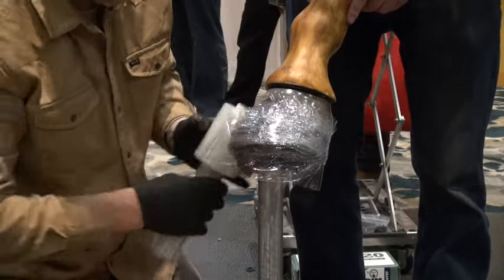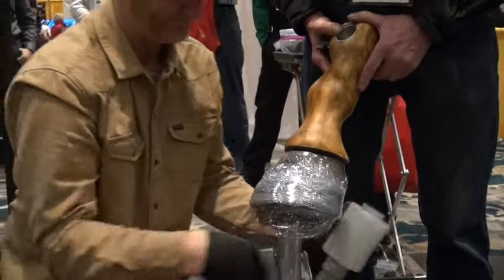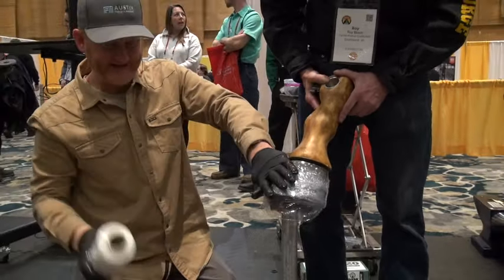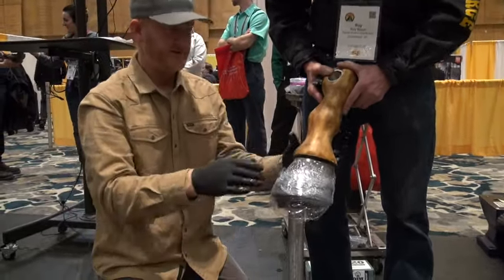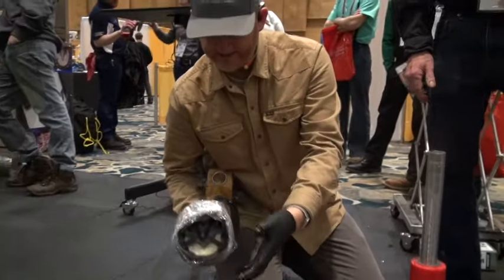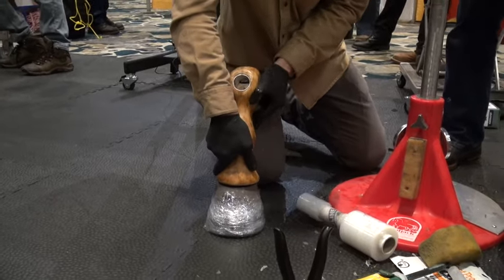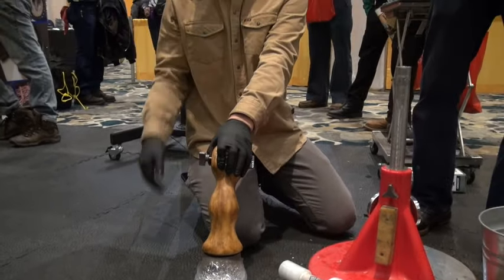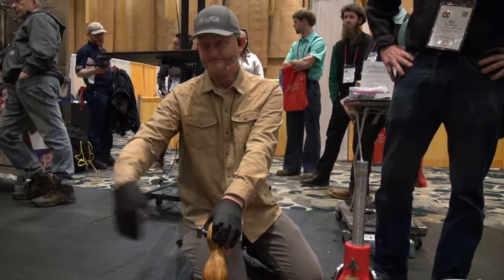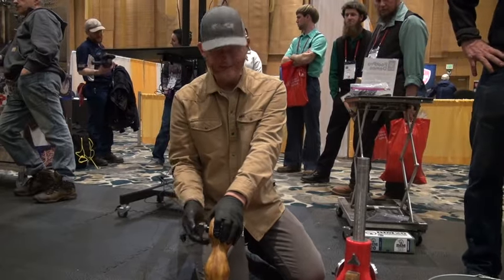Going around and around. It wraps great, it keeps everything in place, nice and tight and clean while you're waiting on that. Now you see everything's irregular on the bottom, but when that horse is bearing weight you're going to push it flat. I'm just going to let it set up while I'm doing the other foot — you're going to be bearing weight on this and then it makes everything perfect. It'll be a nice clean tidy job.